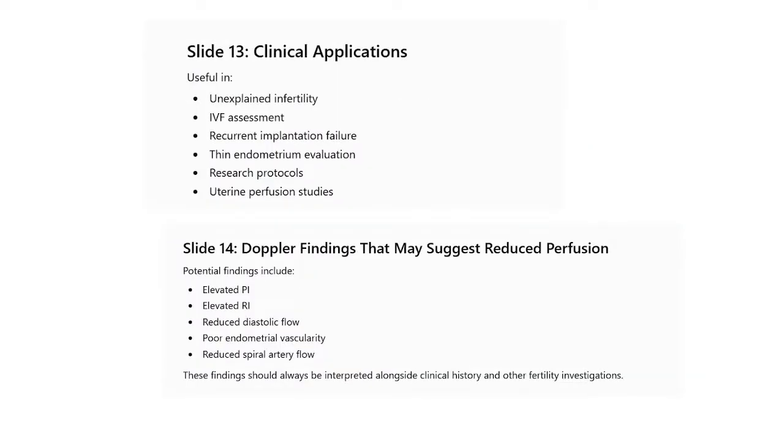So the clinical applications: useful in unexplained infertility, IVF assessment, recurrent implantation failure, thin endometrial evaluation, research protocols, and uterine perfusion studies.